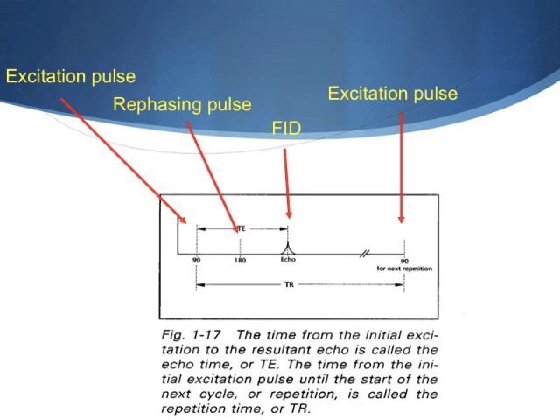Okay, so let's look at everything on one line. Very, very basic. Start from the beginning to what we've covered so far. So the first thing that happens is a patient goes into a magnet. All the protons line up with the pull of the magnet, which is the main magnetic field. You will see graphically illustrated with a capital B and a subscript 0. It can also be referred to as the longitudinal plane, the Z state. All of these words are used interchangeably.